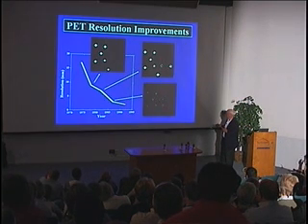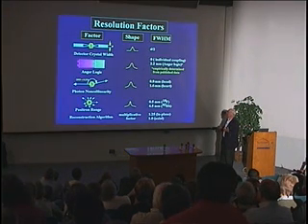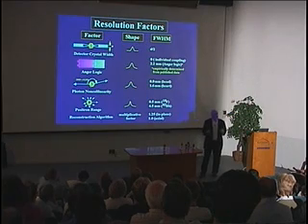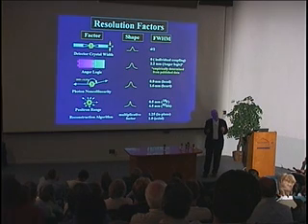This star pattern is what we can get. I know there's some physicists in here. I'd just like to make a point that they'll say, well, the positron range will kill you, not for all radionuclides. For fluorine-18 in particular, it's only 0.5 millimeter. And the components of resolution here, you see on the left. I don't think you want me to go through it, but I would like to emphasize to the physicists here that it is possible to get less than 2 millimeter resolution in a rather large machine, and it is possible to get 0.7 millimeter resolution in a small animal machine.